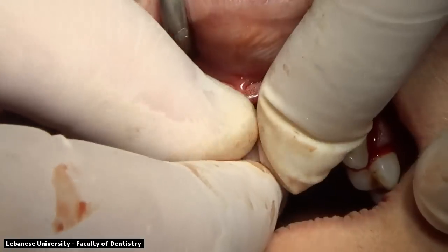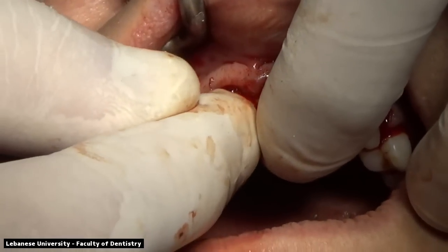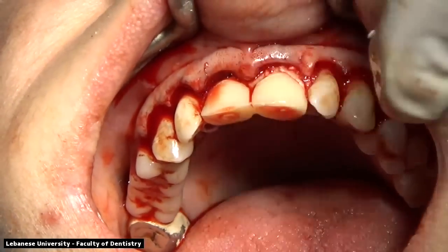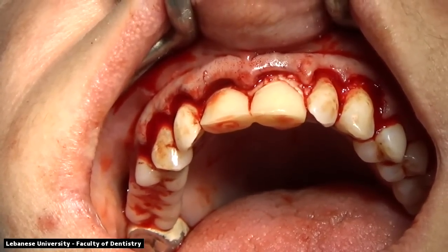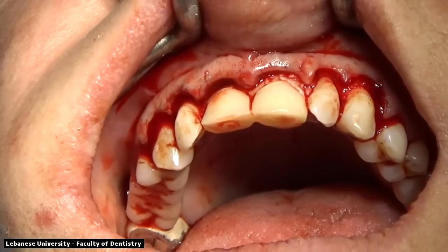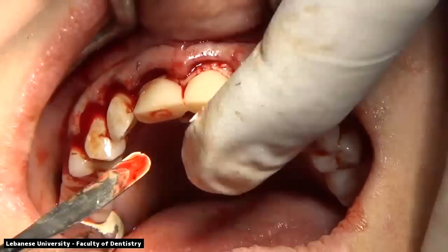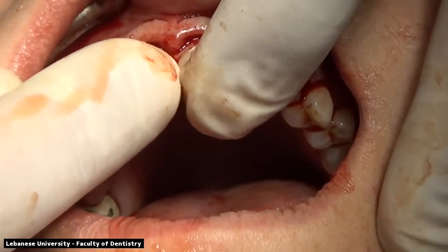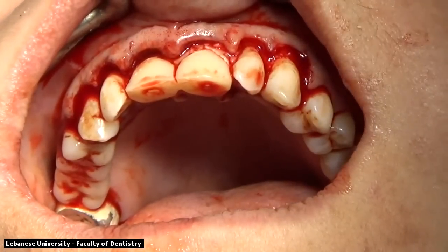Okay, so we removed the acrylic temporary restoration, and we're readjusting it and making sure that it's well adapted. We might need to reline some of the margins of this restoration, so we're going to adjust it before and then see if it needs any reline. We're removing the palatal flap as well to make sure that it's adapted to the palatal abutment.